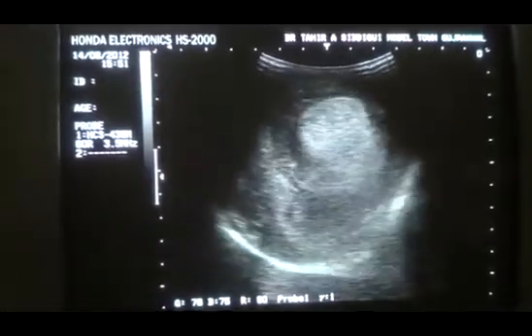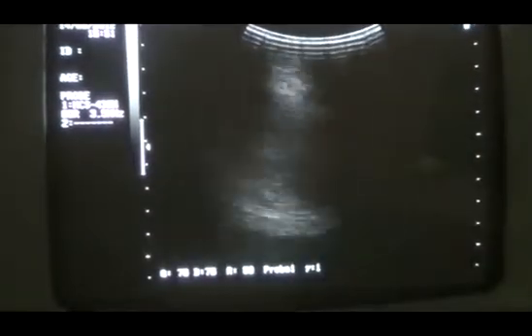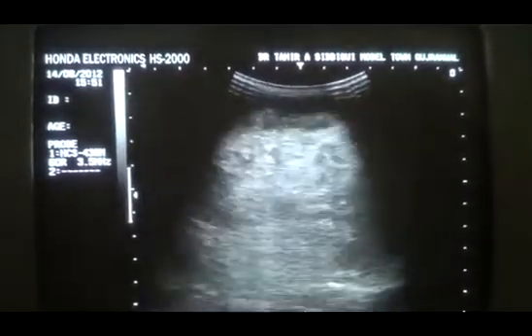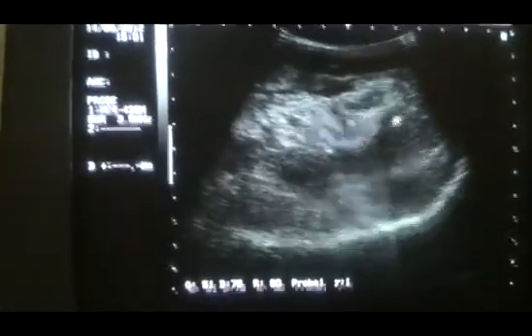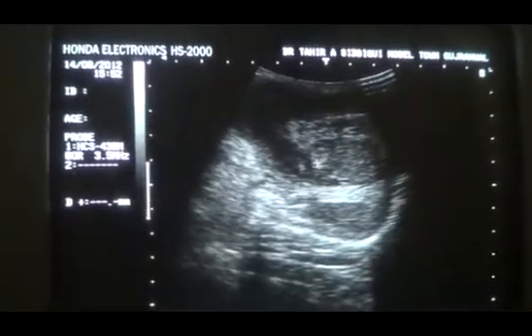So this is straight away a case of collection in the lower abdomen, extending into the subcutaneous tissue as well as the right lower abdominal quadrant. Because the patient was operated for left inguinal hernia, the bowels have entered into the left scrotum that is in front of you. Now you see this is the left scrotum in total with bowels. So scrotal hernia, the bowels are in the anterior part. This is the testis in transverse section. This is the right testis, this is the left testis.